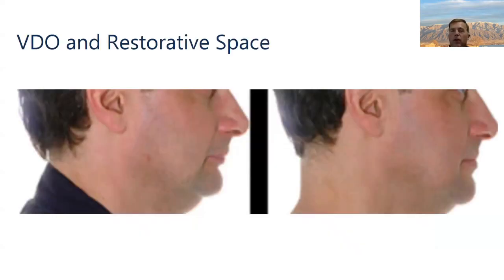VDO and restorative space. One of the things that people sometimes forget is that if I need to open the VDO a little bit, it also gets me more restorative space without surgery. And this kind of points to the holistic nature of treatment planning. So until I get the teeth in position, I don't know how much alveoplasty I need. If I don't know what kind of restorative material I'm going to use, I don't know how much restorative space I need. So this all works together.